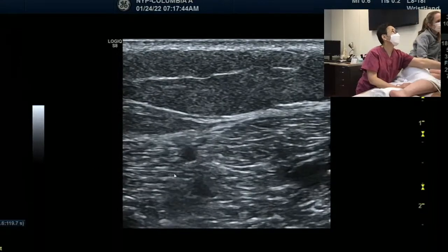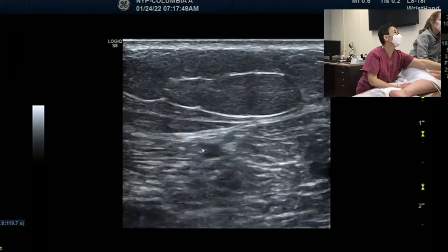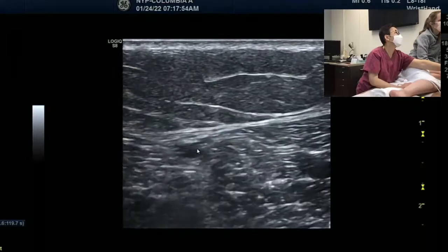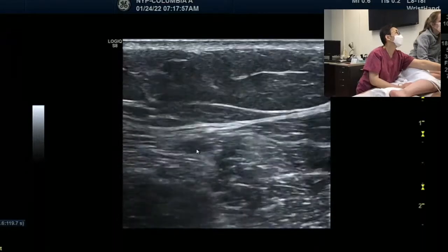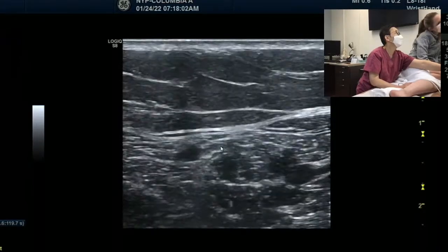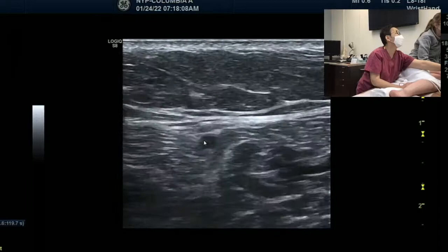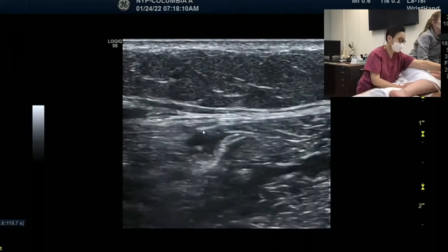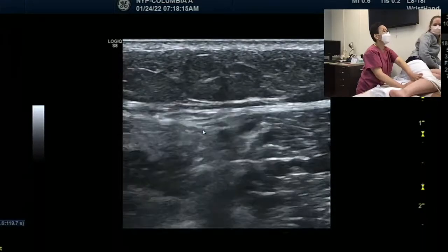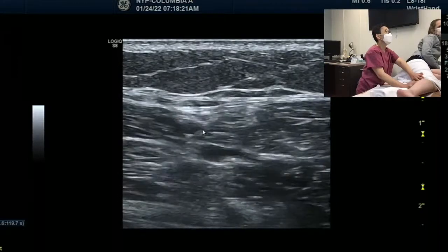Here, now we are here. This one. It's moving, right? Do you see that it's moving? It has to merge to the tibial nerve. Here. Almost in the middle. Look, look. So the tibia goes like this, right? Here.